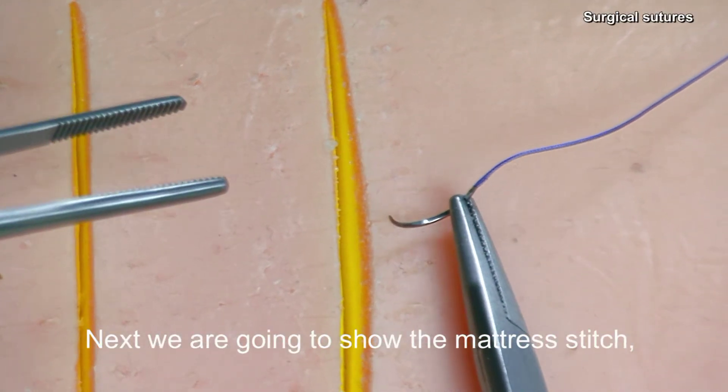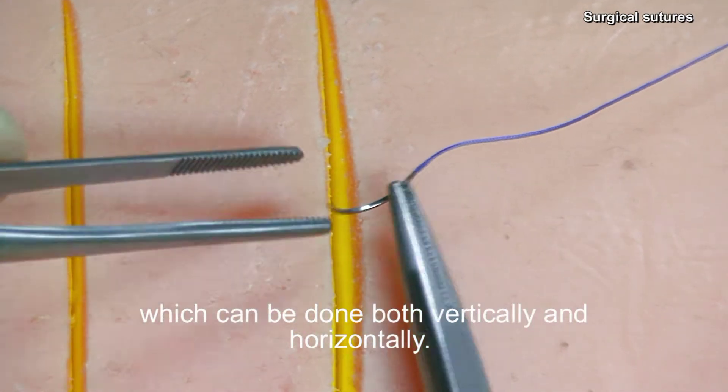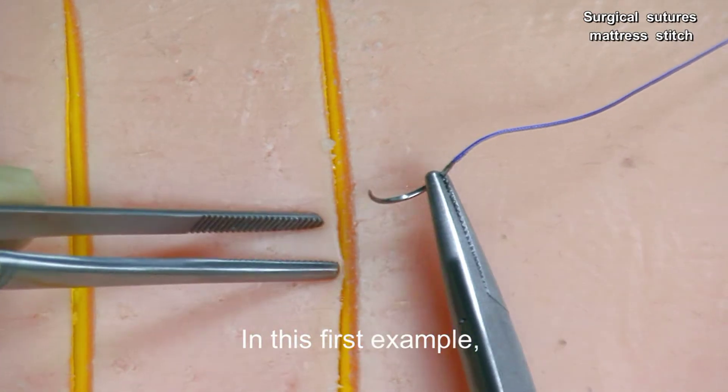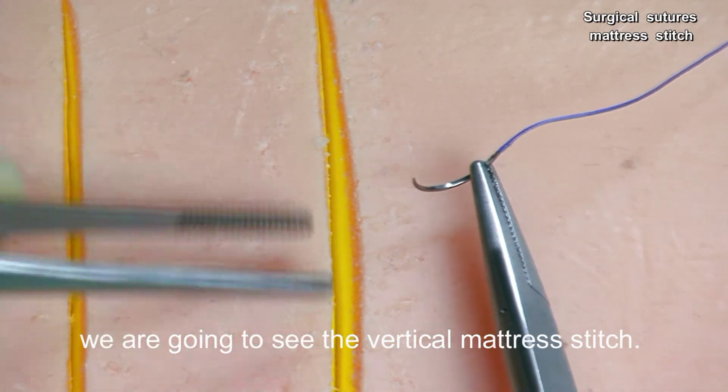Next, we are going to show the mattress stitch, which can be done both vertically and horizontally. In this first example, we are going to see the vertical mattress stitch.